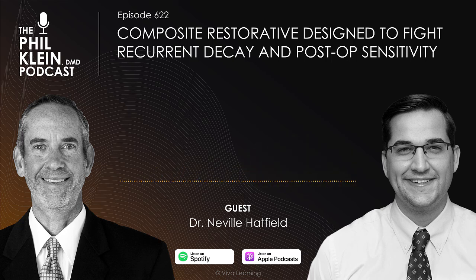But when we're talking specifically about postoperative sensitivity, especially with composite restorations, we need to think about a couple things that are sometimes material in nature or sometimes iatrogenic in our hands. So there's a couple different things that could occur that could cause a sensitivity. The first and foremost is obviously the material itself. Say something like shrinkage stress, right? We've known since the advent of composite resin dentistry that shrinkage stress has been a big thing, and they've been fighting it heavily to not have as much shrinkage stress in R&D in various companies. But most companies have now kind of figured out how to minimize the shrinkage within the resin chemistry, so you don't really have that happening anymore.